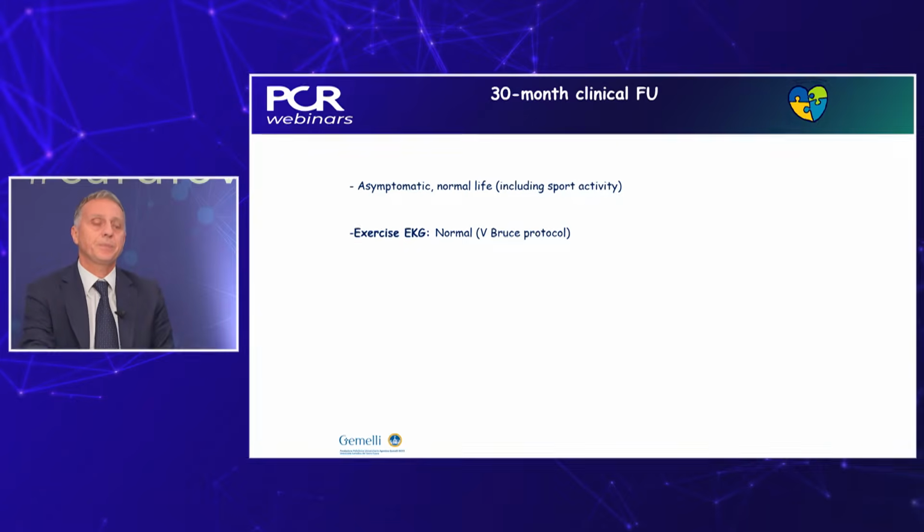We have several questions. We should try to be very focused and answer. Dr. Huma is asking, what would be the recommendation of the panel if there is significant disparity of diameter between the left main and the circ, and you have again isolated ostial circ? What would you do? I think that what is very important to recommend is to know very well, first of all, the sizes. So this mismatch should be verified by intravascular imaging. And the other point is to select a platform that is able to accommodate these differences. So you should know very well the drug-eluting stent you have in your lab.